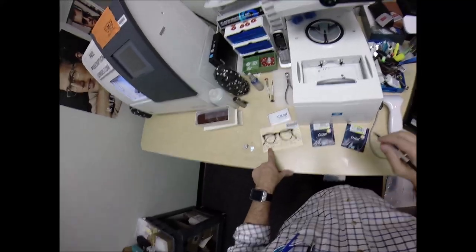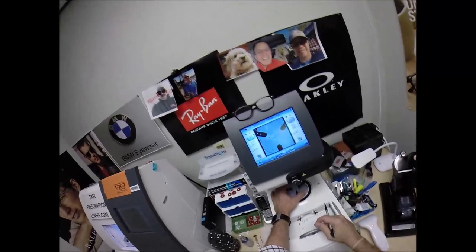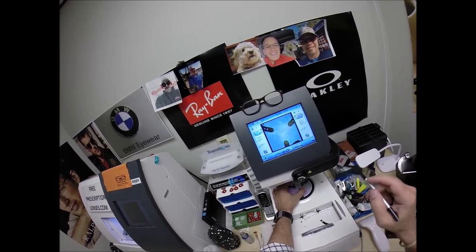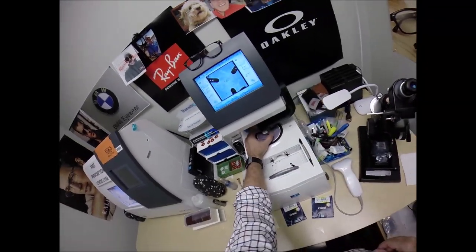Your pupillary distance for your left eye is 30, so we're going to hit the plus button until we get to 30. Get everything lined up here. Hit that button. The arm's going to come down and place the block onto the left lens.